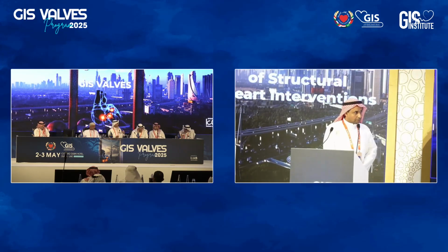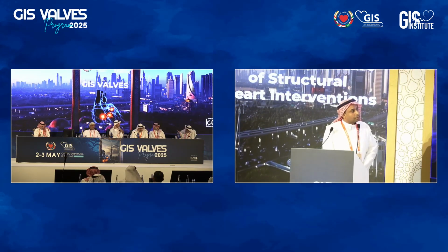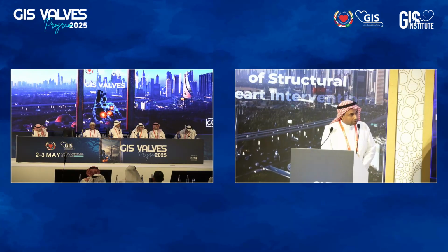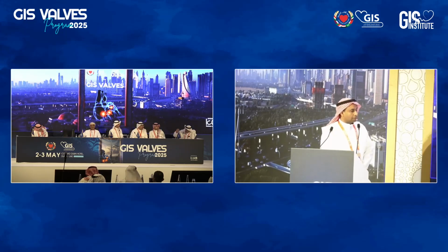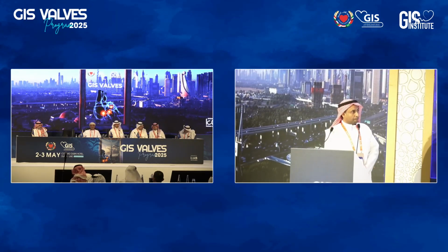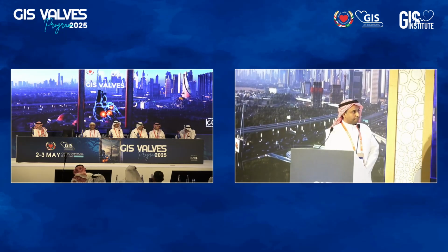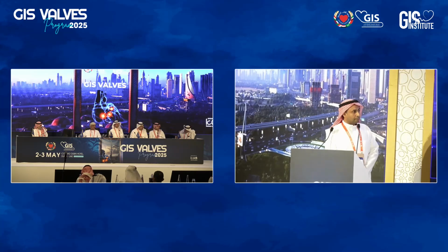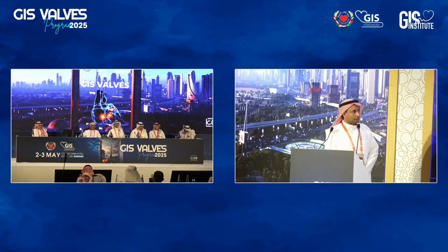Dr. Faisal, I think the comment is similar to Dr. Mohammed's, but I think you did the right thing, Dr. Salem, by not jumping and putting another valve, because the valve position was not stable, and I agree with Dr. Mohammed. Embolization is going to be going to the LV. The mechanism of the MR, I probably did not understand it from the TE, but if there is an injury, then as mentioned by Dr. Mohammed, the mitral clip will not be a solution.